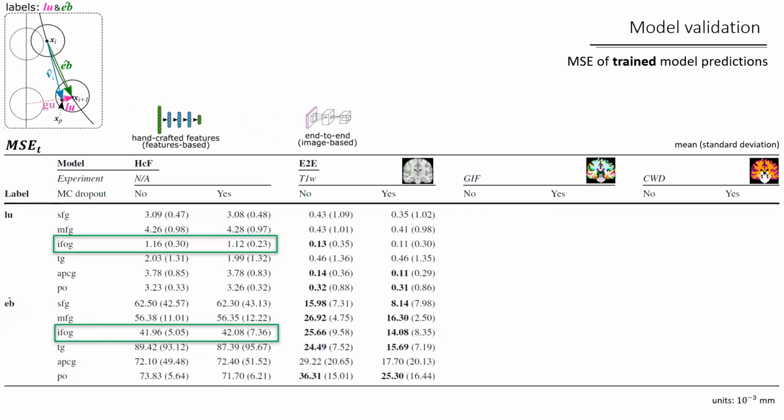However, when we infer trajectories, only 24.2% of the predictions had an MSE below 1 millimeter when using electrode bending, compared to 82.3% when using local displacement.